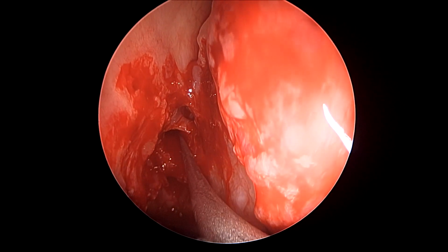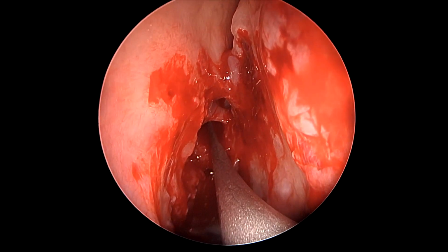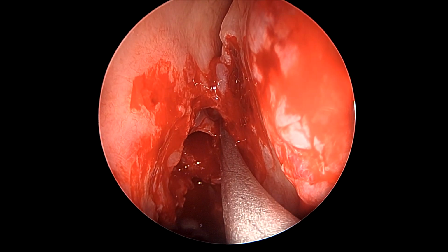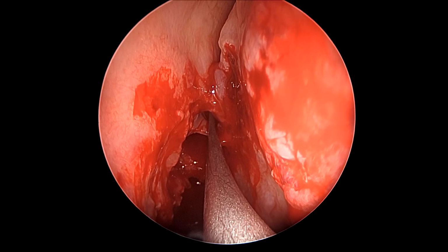Our navigator probe here confirms the same, that this is the frontal sinus indeed, which is slightly posterior and lateral, and the other recess that you see here, this one, is basically the interfrontal septal sinus cell, which is medial and even more anterior to the frontal sinus.